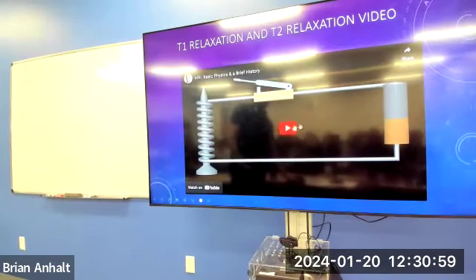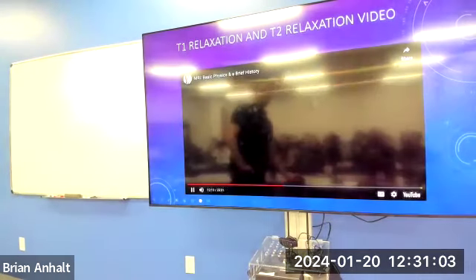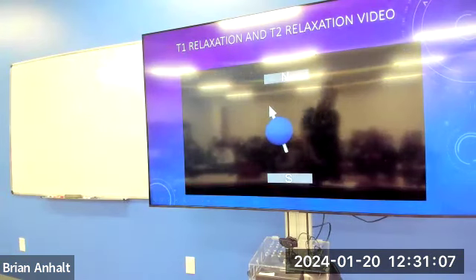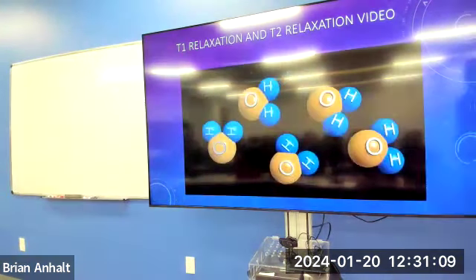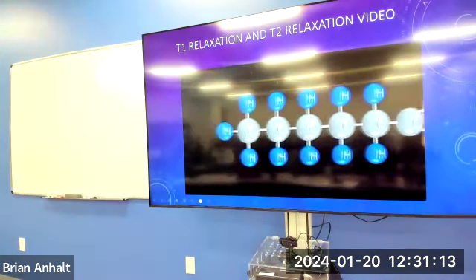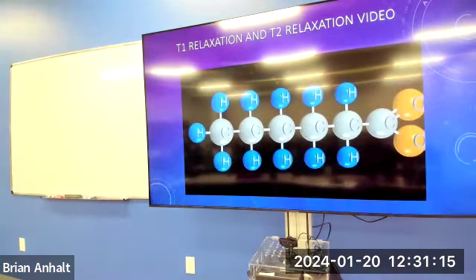All right, here's my favorite video with the sweet guitar playing. This actually starts. Because these protons in our bodies have different local environments, some associated with the free-flowing water molecules, while others are fixed in position associated with the structural or energy-storing molecules of protein and fat, they have characteristic differences in their T1 and T2 relaxations.